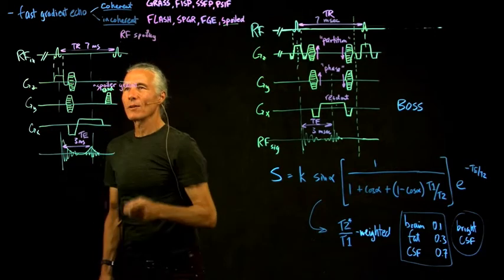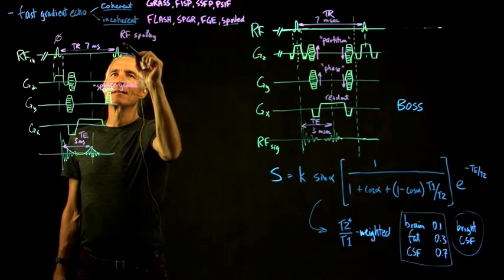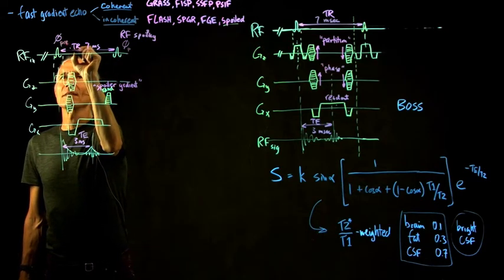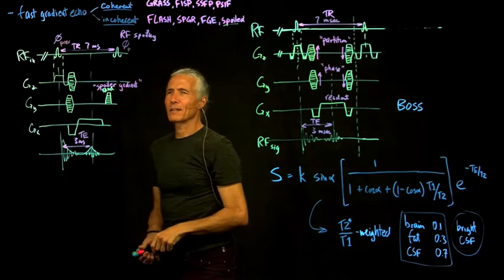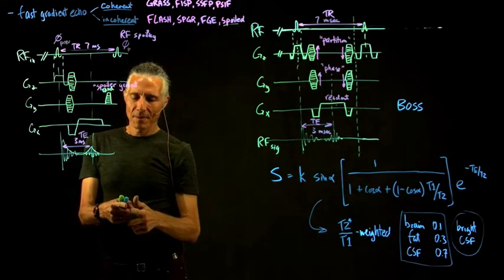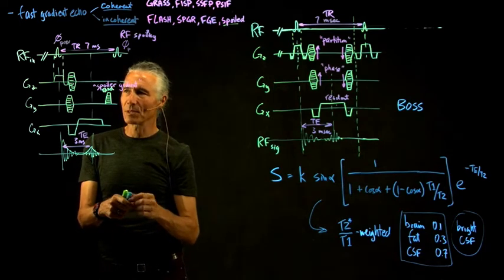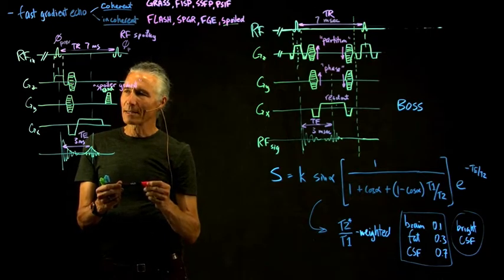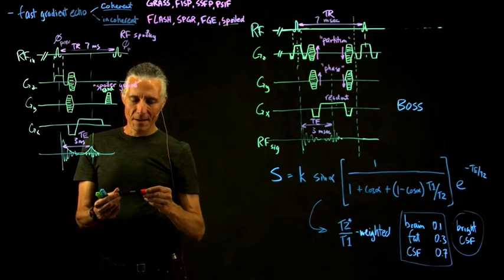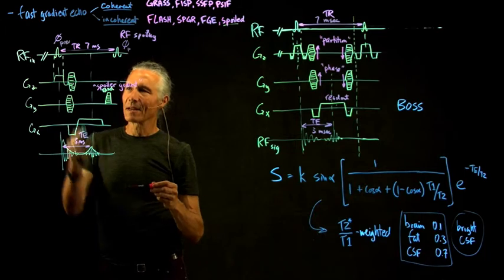So when we do the next RF pulse, whatever the phase of the previous one was, we set the phase of the next one relative to it. Normally, if we do an RF pulse, we do it with 0 phase if nothing has happened before. That just means we'll start, say, pointing along the y-axis, so that when the transmitter is turned off, it effectively starts time t equals 0 at a 0 phase angle.